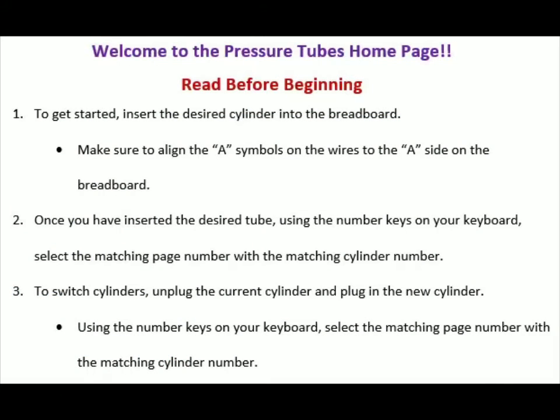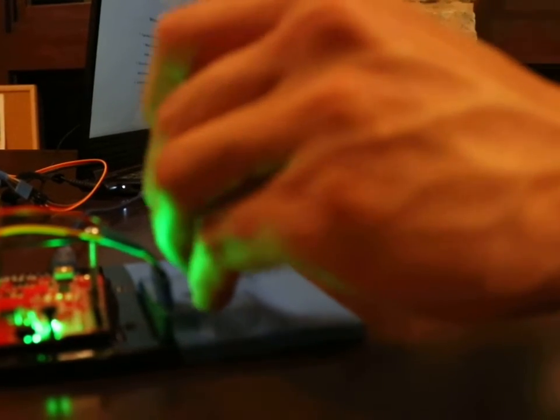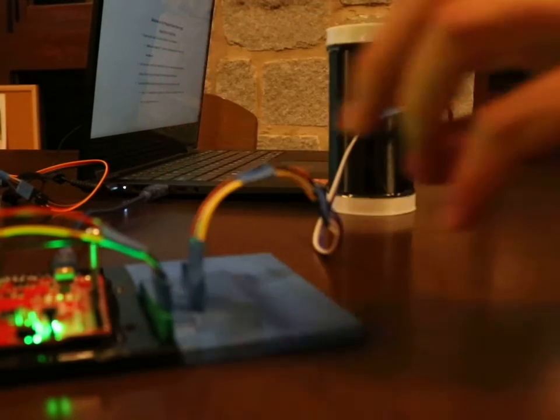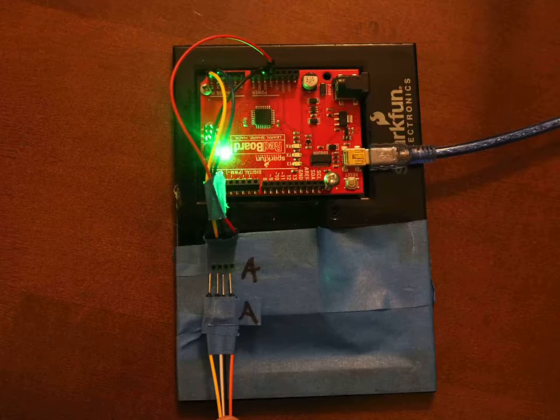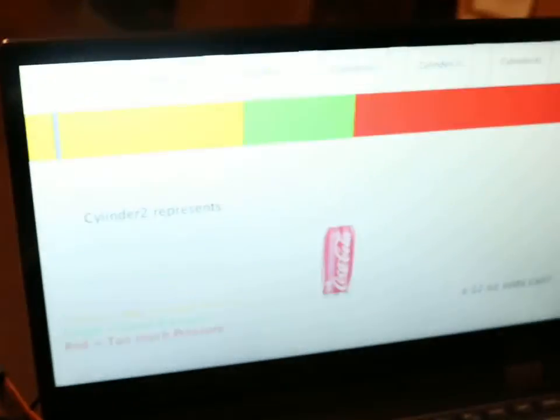The initial homepage of the program has a set of instructions that the user must follow in order to correctly use the product. First, you must plug in the desired cylinder into the breadboard. Make sure to align the A on the wires to the A on the breadboard. Once this has been completed, you must choose the corresponding tab that matches with the corresponding cylinder.